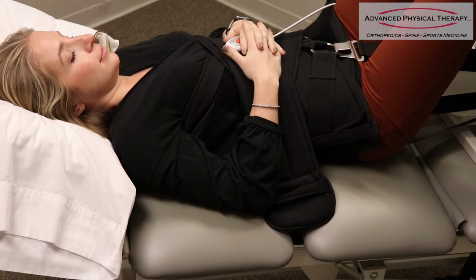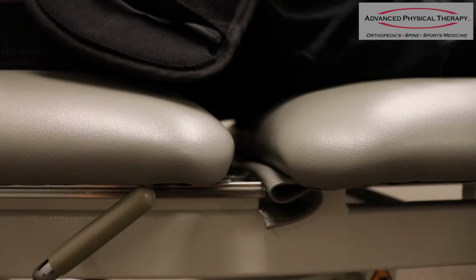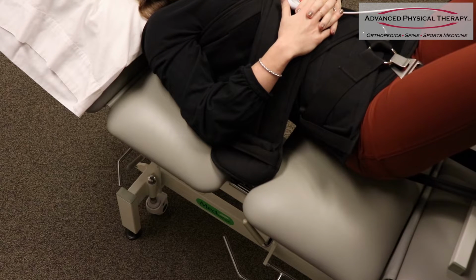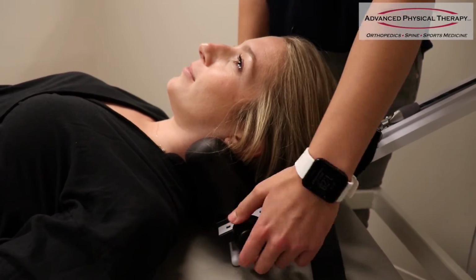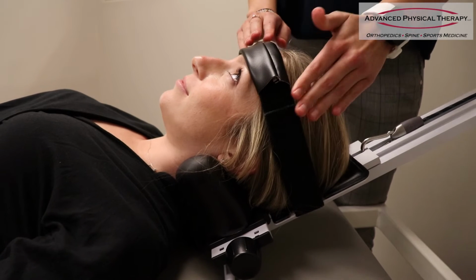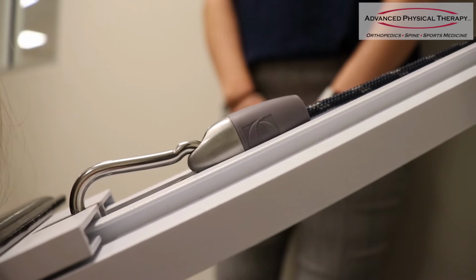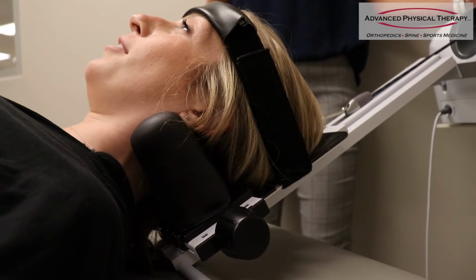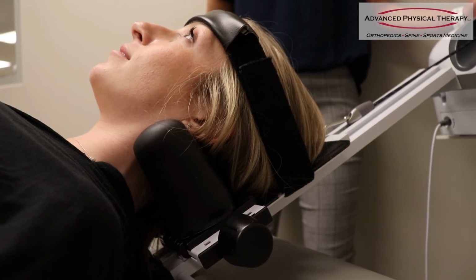Typically, you're looking at about 10 minutes to be on the traction device. Depending on where your pain's coming from and what's really causing the pain, we can either set it to where it's getting you to that maximum stretch and holding there for the 10 minutes, or we can set it to where it kind of pulses, where it pulls for about a minute and then relaxes out of there for 30 seconds at a time. The traction will give that joint distraction to relieve the compression that's being placed on those nerve roots so that patients aren't experiencing that pain down the leg or the arm.